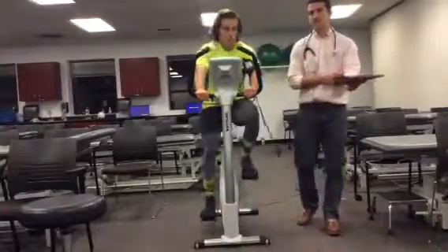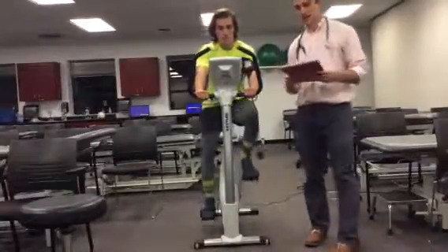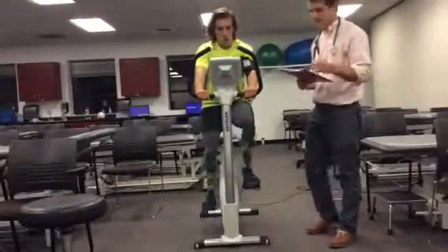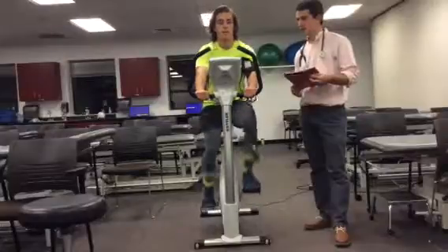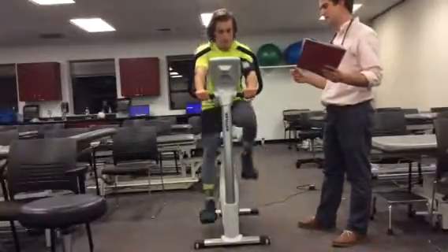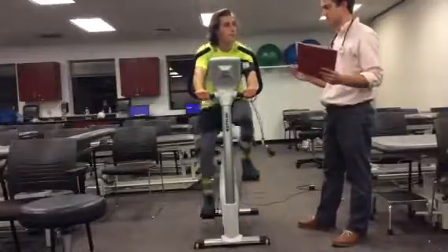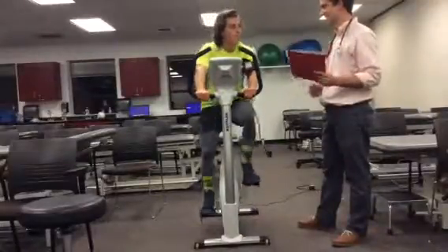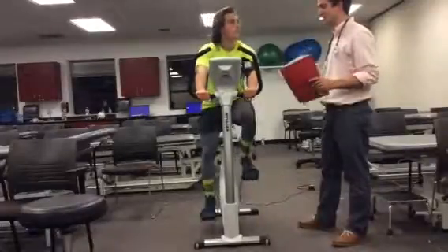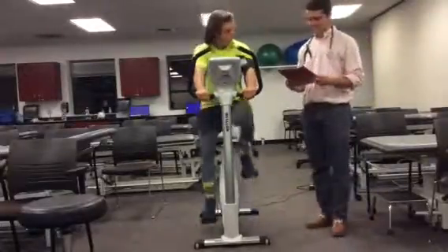During this time, he's going to continue doing a pace of 50 to 60 revolutions per minute. If at any time during the test you start to feel lightheaded, dizzy, or just uncomfortable in general, let me know. We can terminate the test at any time. I'll be monitoring everything, and if I see anything unusual, I'll also terminate the test. Thanks, Doc.